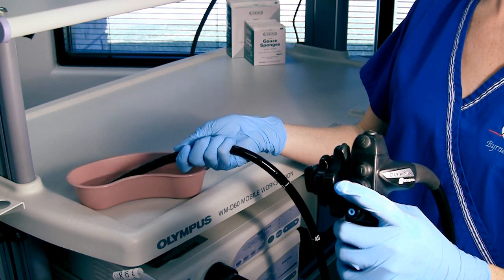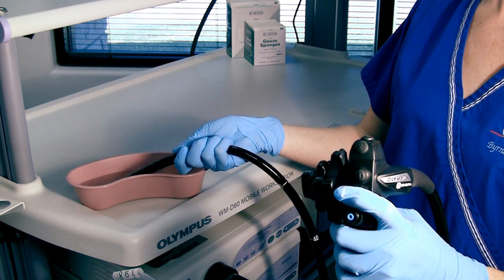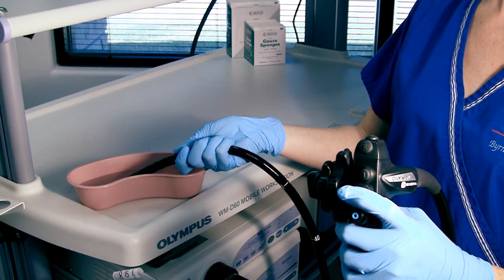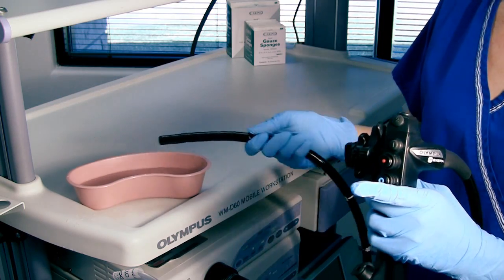Finally, submerge the tip in the water again, this time depressing the suction button. Listen for a sucking sound and watch the water levels. If the water level is lowering, then the suction function is operating properly.